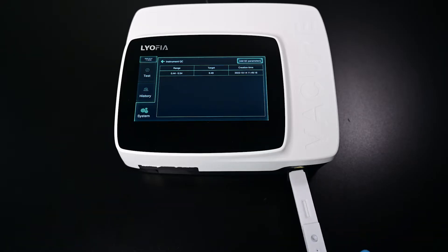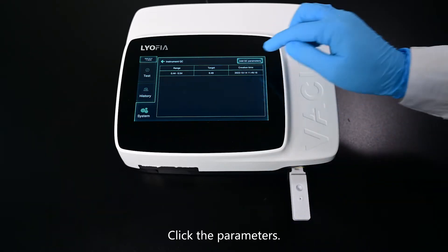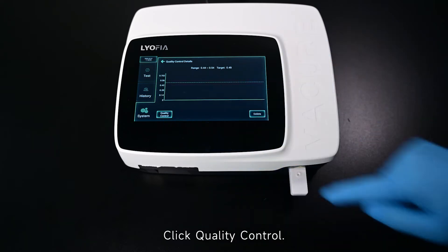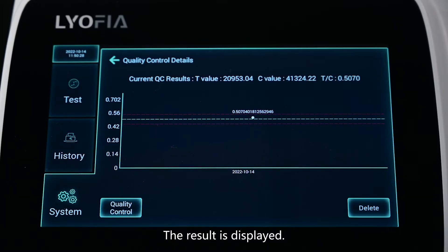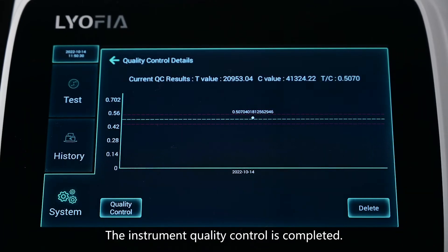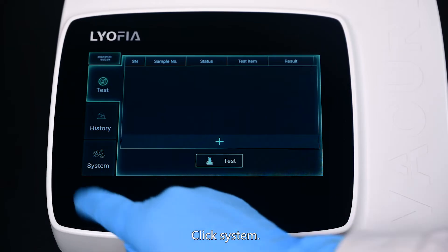Insert the QC card, click the parameters, and click Quality Control. The result is displayed. The instrument quality control is completed. Click System.